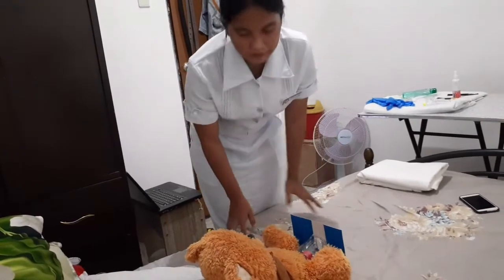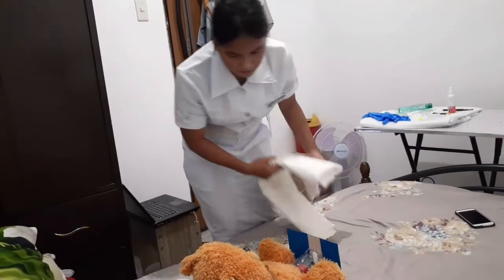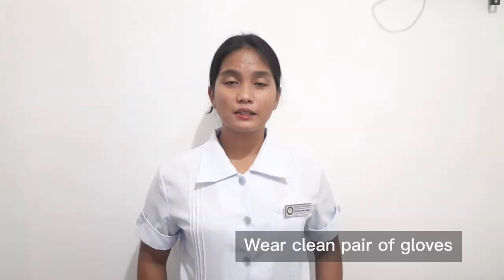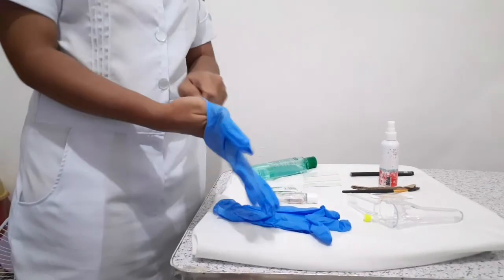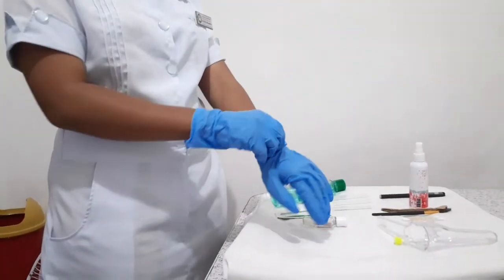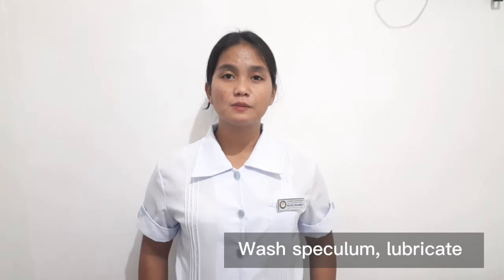So, let's assume that Ms. Santos is in a dorsal lithotomy position. Then, let me drape the patient, exposing only the pelvic area. Then, wear a clean pair of gloves. And most importantly, wash the speculum with warm water, lubricate, then insert the speculum into the patient's vagina.